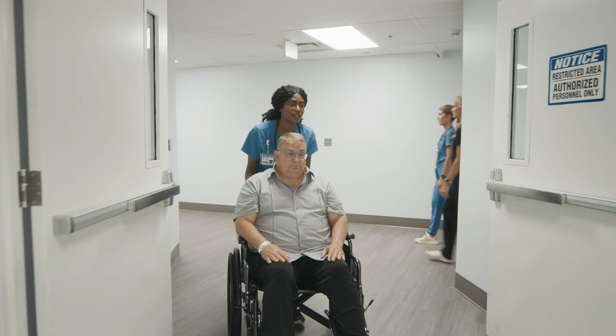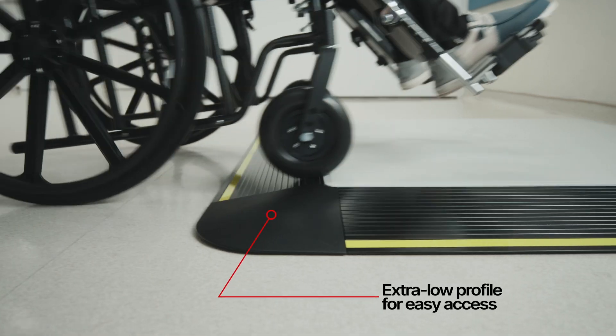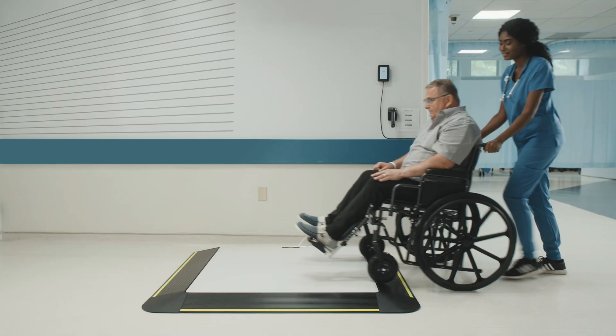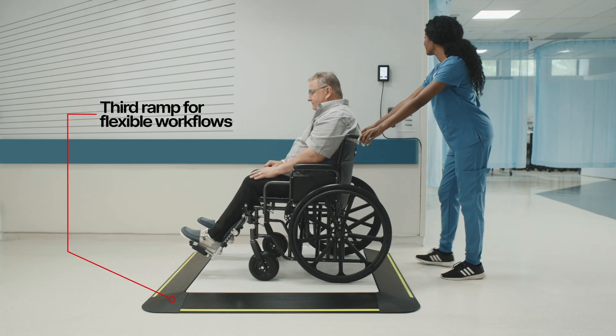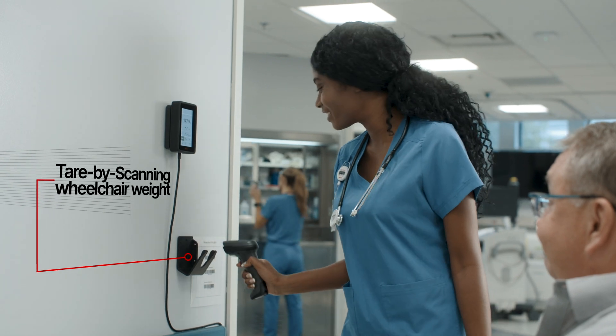Weighing patients with mobility challenges just got easier with the X-Line by Sika. The platform scales easily fit into your workflow and reduce the risk for injury of the nursing staff. It accurately measures patients of all mobility levels.